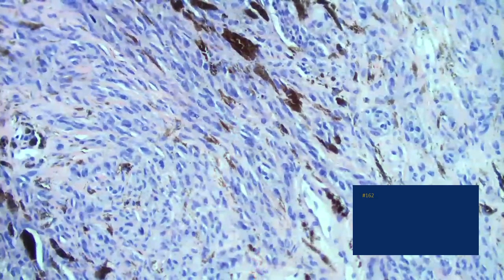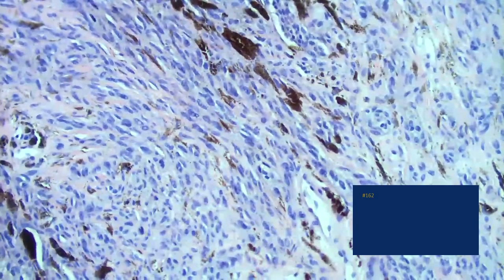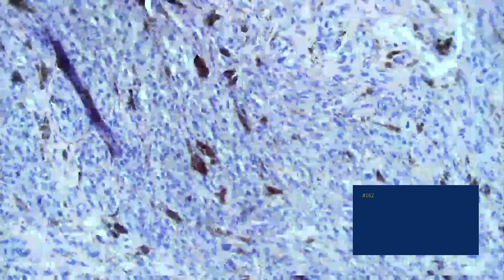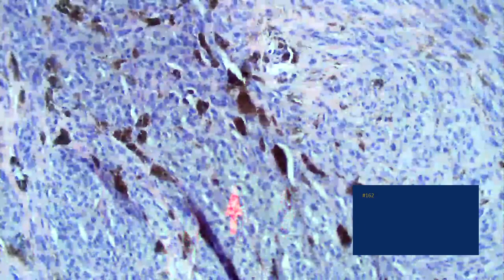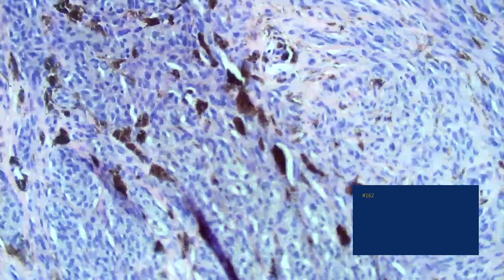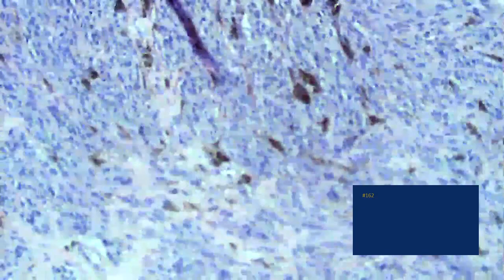We talked about the different patterns of melanocytes a minute ago. Notice the absence of mitotic figures. Notice that some of the cells have relatively abundant cytoplasm. So if you took that cell and transplanted it at the dermoepidermal junction of the so-called dysplastic nevus, it looks pretty similar. Same thing with some of these cells near the base.